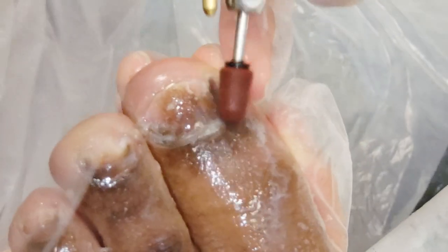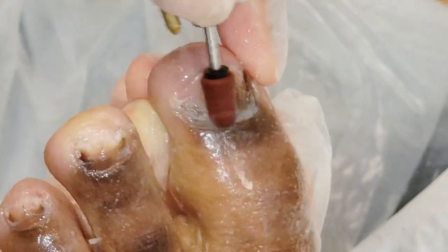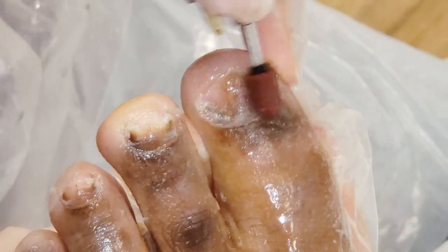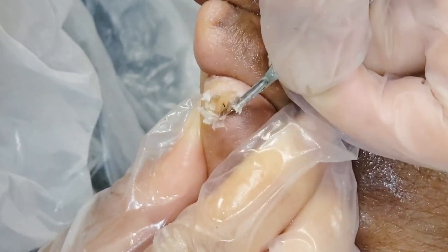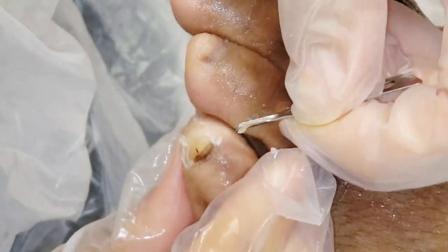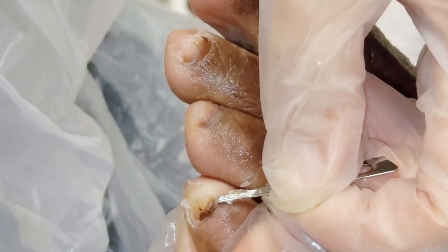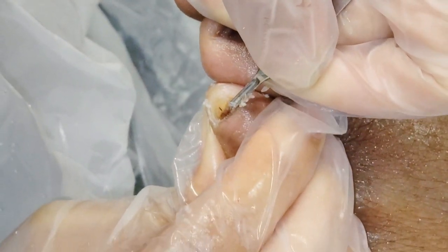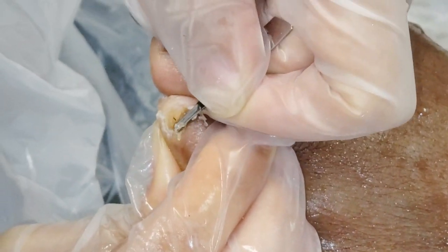I'm trying my best. We'll probably have to stop soon because it's going to get tender. How is it feeling? Feeling okay. So we're just cleaning all this dead nail off as much as possible without doing the surgery. This is a non-surgical procedure — it doesn't have any anesthetic because you don't really need it.